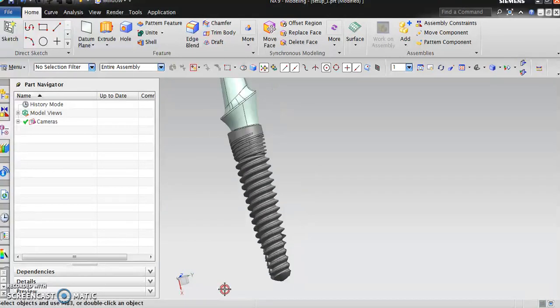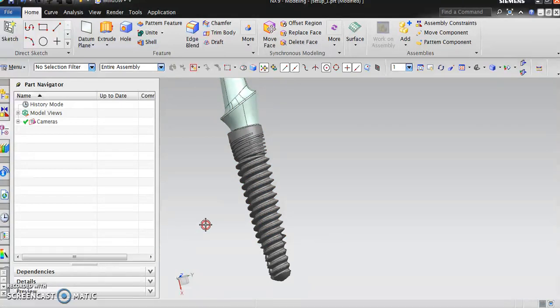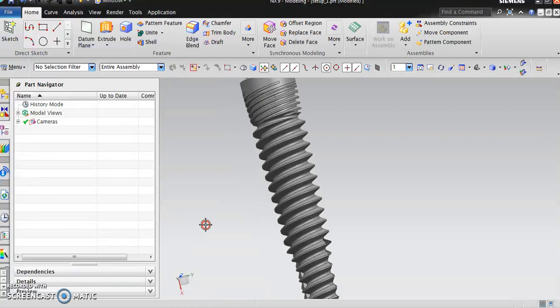You can see the threads. These are called the buttress threads. When you think about a thread, there are two different flanks: one is the clearance flank and there's a loading flank.